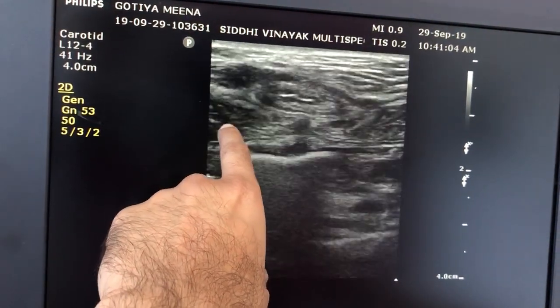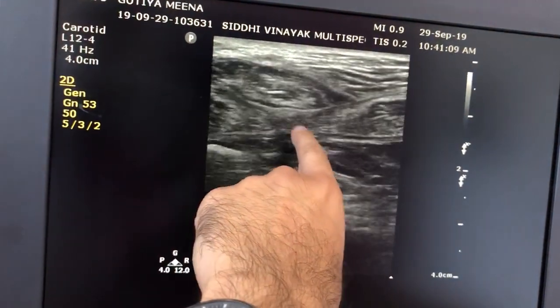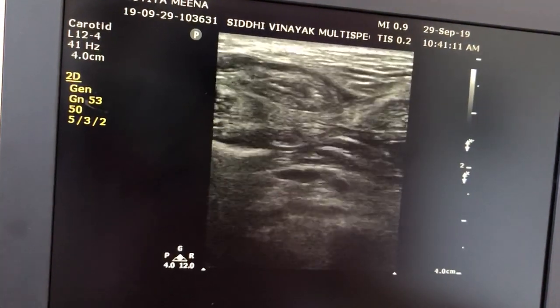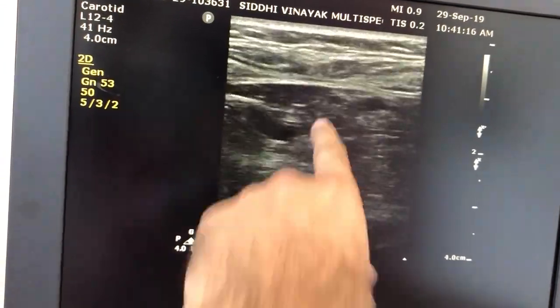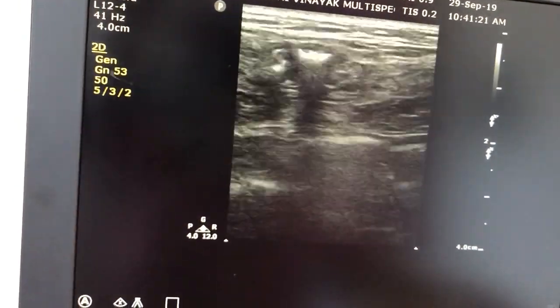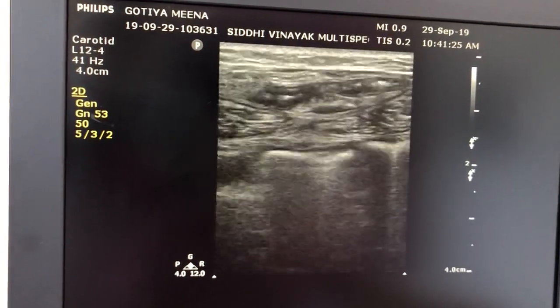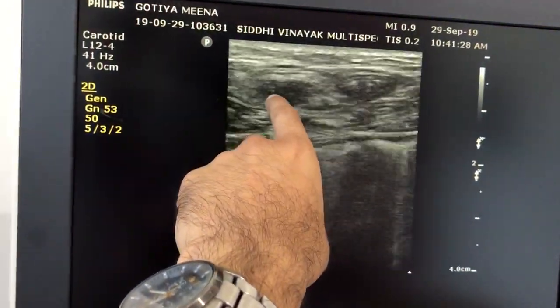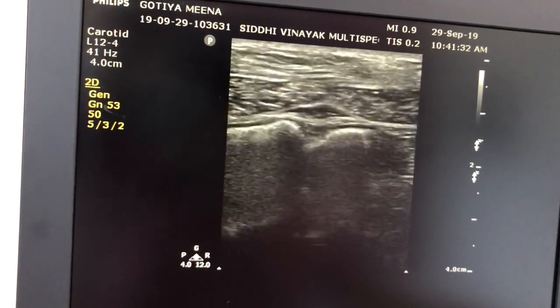This is the rectus abdominis muscle. This is linea alba. Here it is a little bit swollen. Thickness is increased as compared to here in the epigastric region. And these small bowel loops, they are superficial to this linea alba. Now this is the inferior part here.